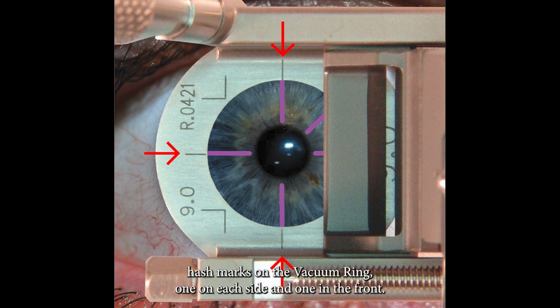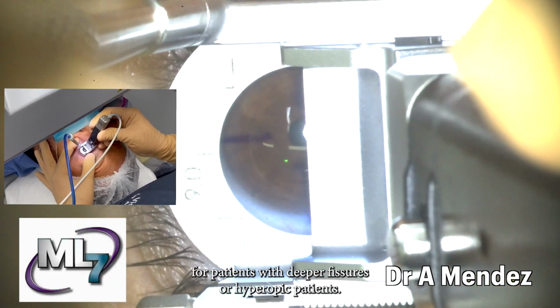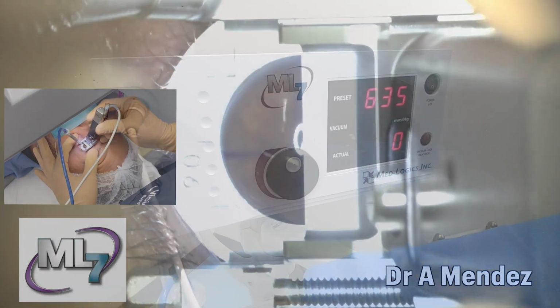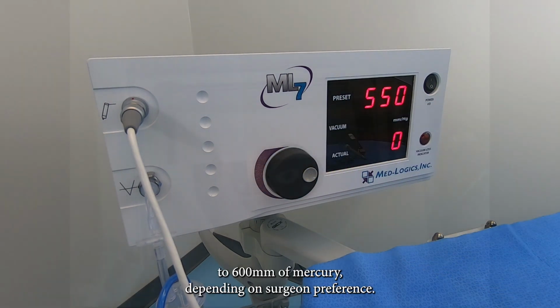There are 3 hash marks on the vacuum ring, 1 on each side and 1 in the front. It's also possible to use the ML7 system without a speculum for patients with deeper fissures or hyperopic patients. It is recommended to set the vacuum at 550 to 600 millimeters of mercury depending on surgeon preference.